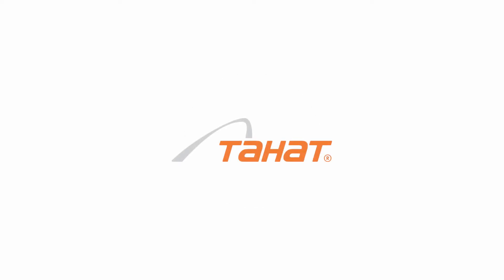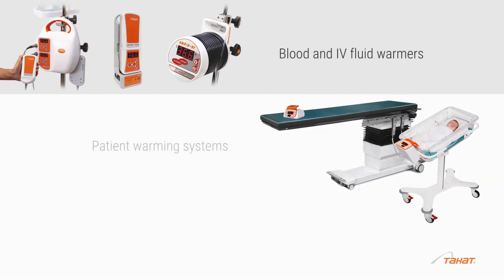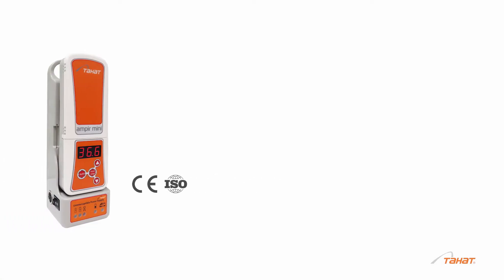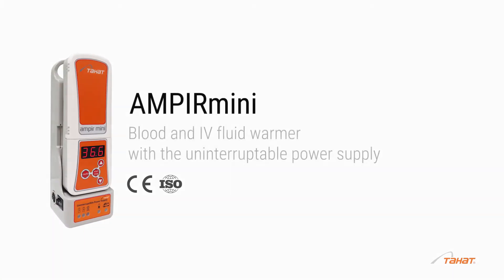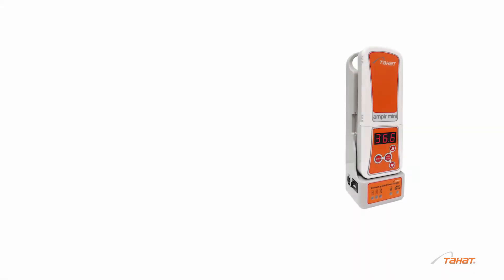Perioperative hypothermia is a serious problem for surgical patients around the world and a reason for many negative outcomes. Tahat Axi has been developing products and solutions for the treatment and prevention of hypothermia for many years. Ampere Mini is an effective and safe solution for blood and fluid warming outside hospitals and hospital wards.